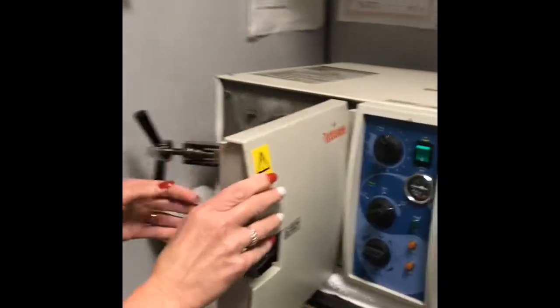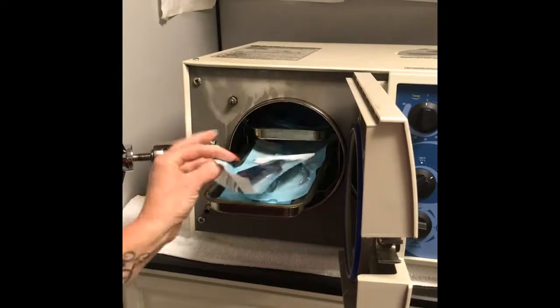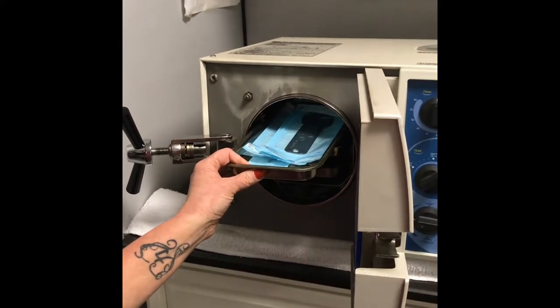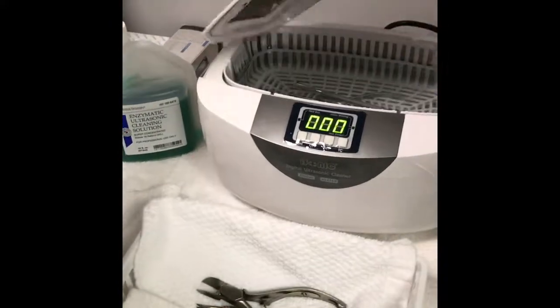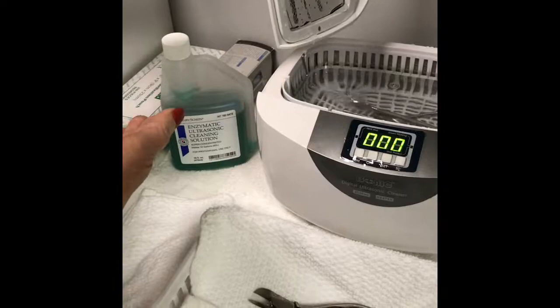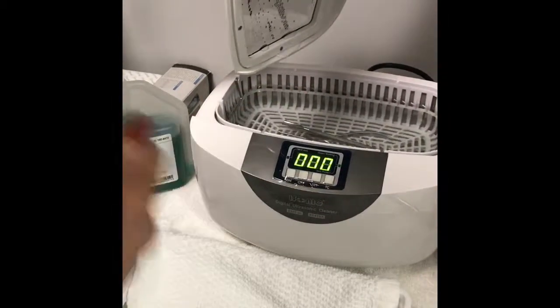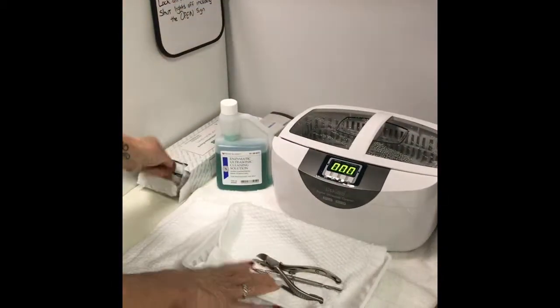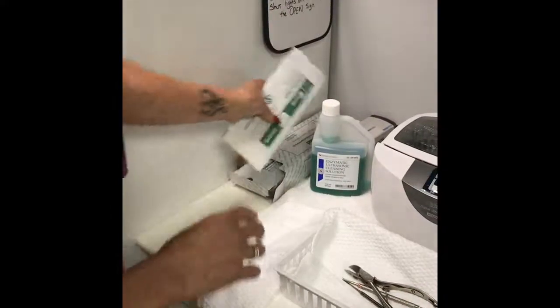Our autoclave has a cylinder-type chamber with three drawers. We load it with implements that have been disinfected — you can run them through an ultrasonic cleaner with disinfectant. We pre-clean our implements with an ultrasonic cleaner using the correct disinfectant changed on a regular basis per its instructions. This ultrasonically removes all the bio-burden and debris from implements before we dry them, place them in an autoclave bag, and then put them into the autoclave itself to be sterilized.